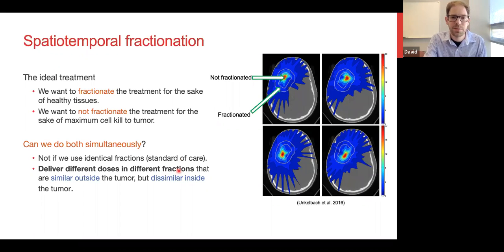And here's a picture that kind of shows how this works. Inside the patient's brain, you see two contours. The inner contour is the target we want to irradiate. The outer contour just outlines a volume around the target, which is basically the part of the brain that's most at risk from over-irradiation.